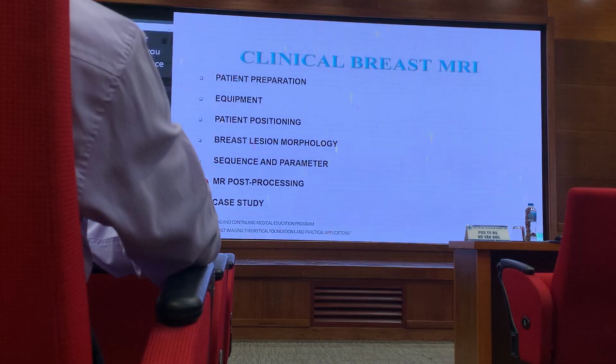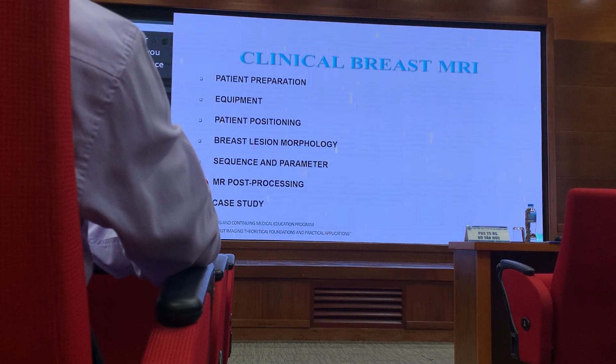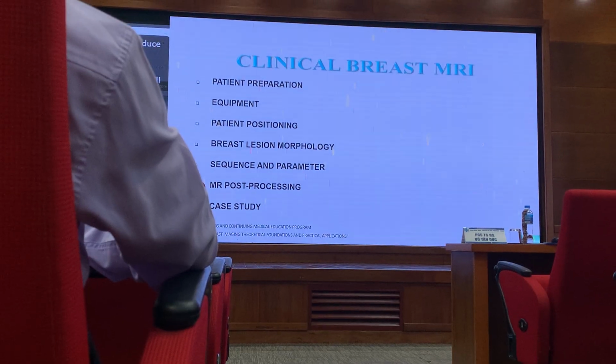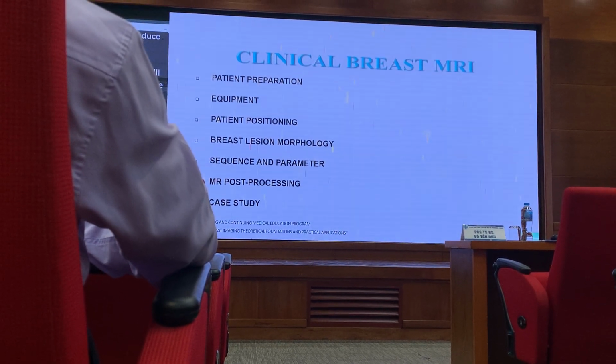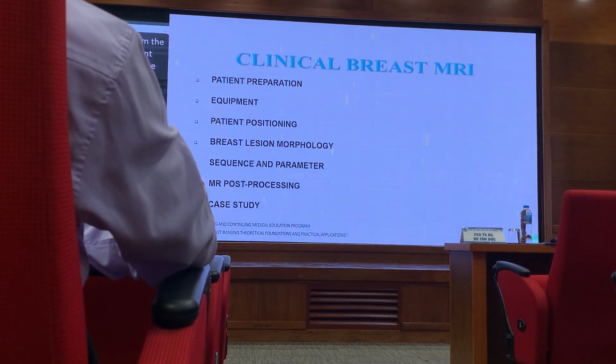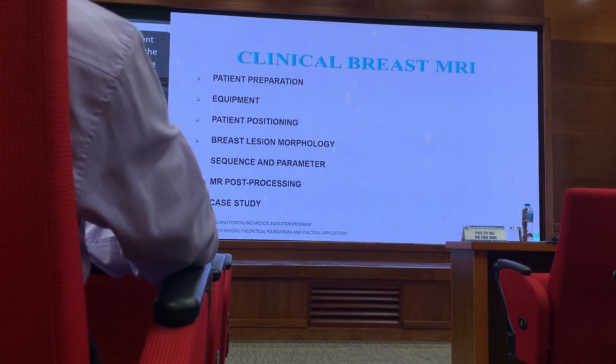In this sharing session, I will cover the clinical breast MRI: the patient preparation, the equipment we are using, patient positioning, the breast lesion morphology, the sequences and parameters used under the MRI breast, MR post-processing, and also some case studies that I can share with you.